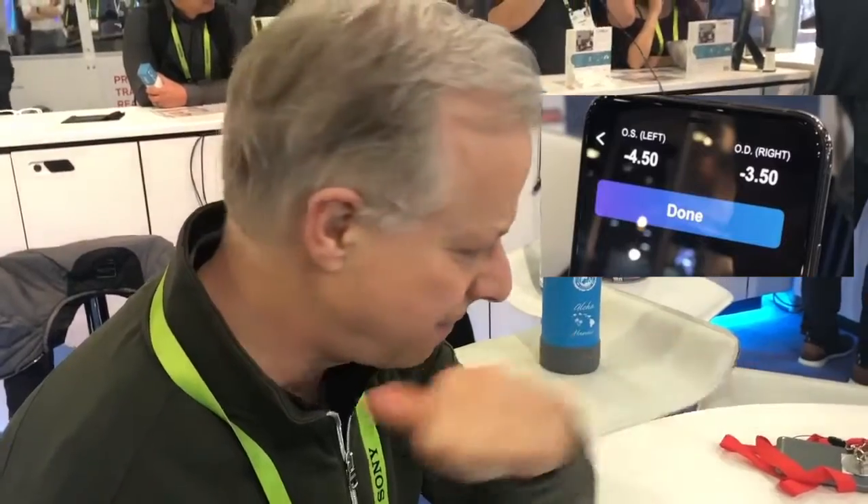I think it's pretty close. The lensometer might have said 3.25 and 4.75 — very close. It's very easy to use and very helpful, a lot easier than going to the eye doctor. It's very easy to use.